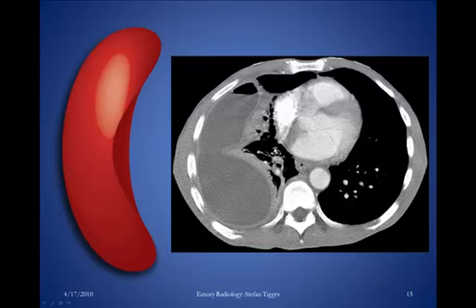Here's a CT scan of that empyema. You can see there's a large fluid collection in the right pleural space, and it does indeed look a little like a banana — it conforms to the shape of the pleural space. This would have to be operated on; the surgeons would take this person to the operating room and drain it surgically.